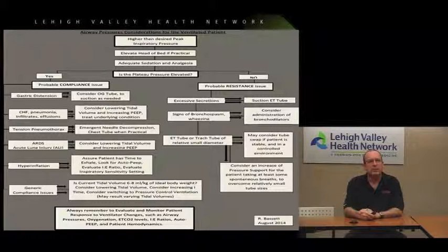This looks like a pretty busy slide. So now we're talking about higher than desired inspiratory pressures, especially with your plateau pressures. Sometimes just elevating the head of the bed can make a big difference.